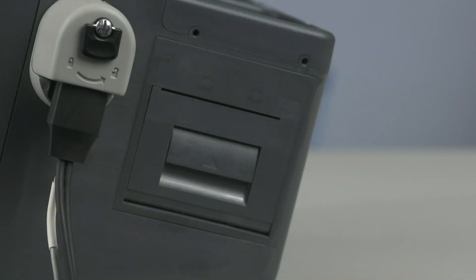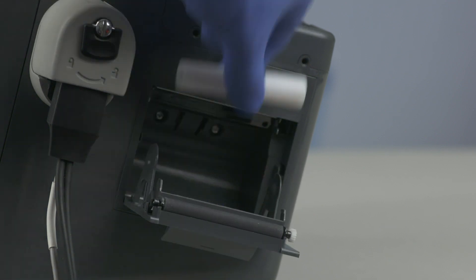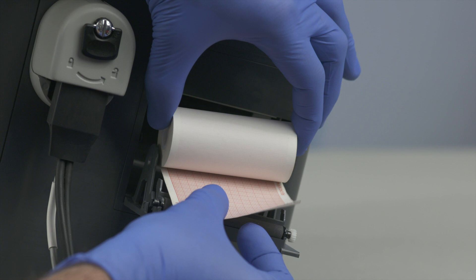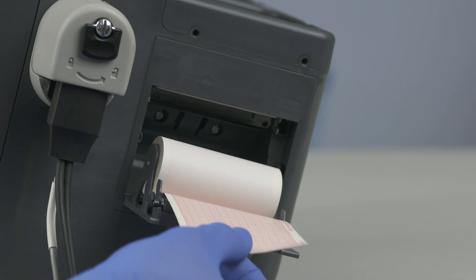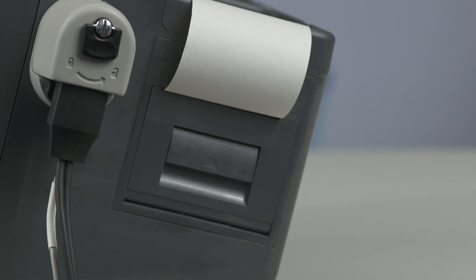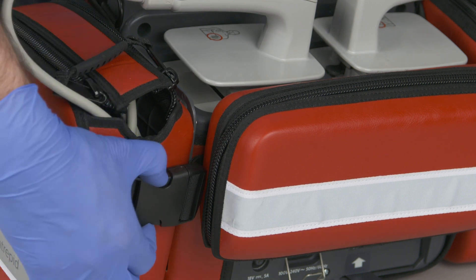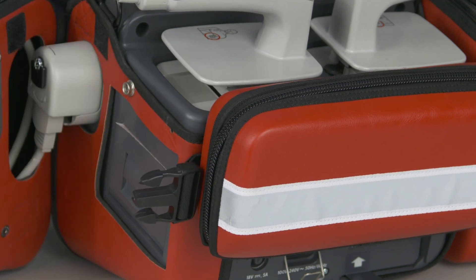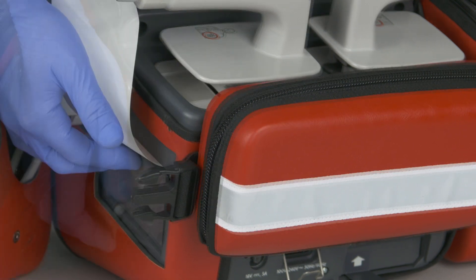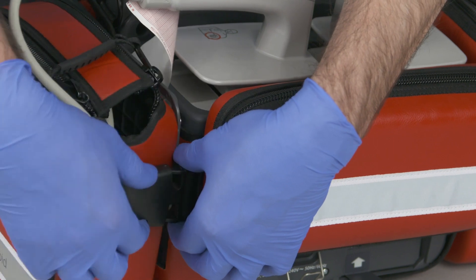To load a new roll of printer paper, open the printer door by pulling up on the latch. Remove the empty paper roll by pulling up on it. Place a new roll into the paper well, positioning the roll so the end is on the bottom. Pull the end of the paper past the paper roll and close the printer door, making sure the door clicks in place. When the carrying case is installed, unlatch the right side by pressing both sides of the latch, swing the side forward, and change the paper as previously described — but leave a few inches of paper above the case when closing the door.